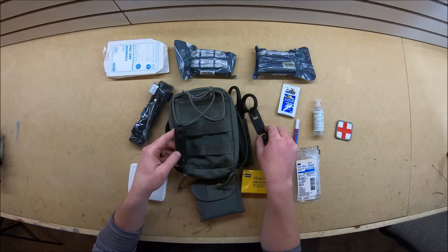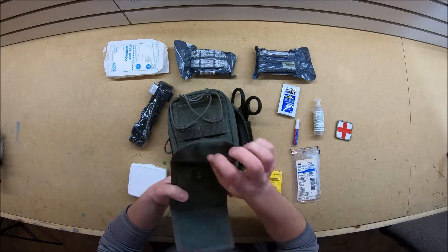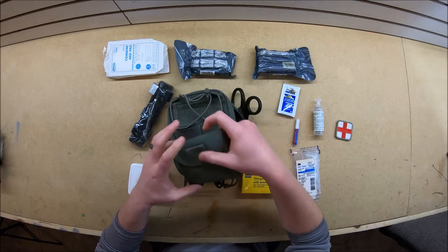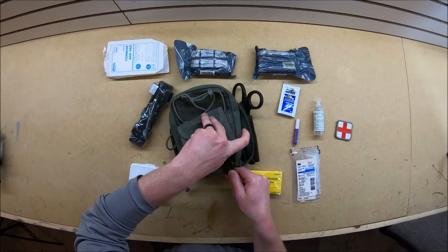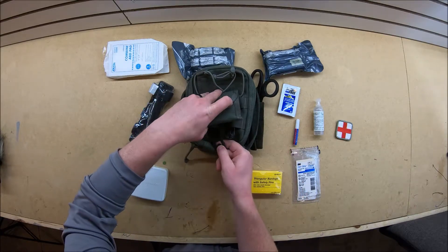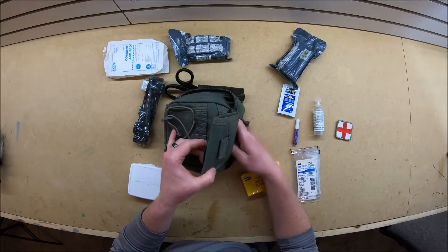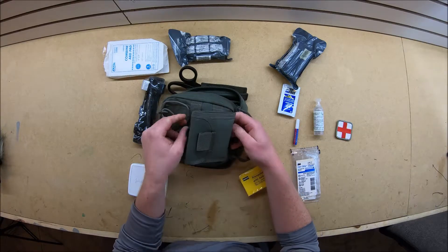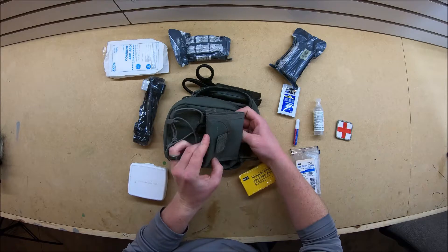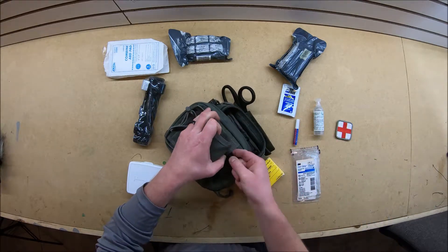The next thing we got - I'll take these Blackhawk speed clips here and slide these in. And this is a Maxpedition glove holder. You can pretty much put anything in here but I like putting some latex gloves in there. I'll just kind of line these up. You're going to slide those up in between the first loop of MOLLE here, tuck them onto here at the top one, and make sure that clip goes down over top - that's what locks everything in.